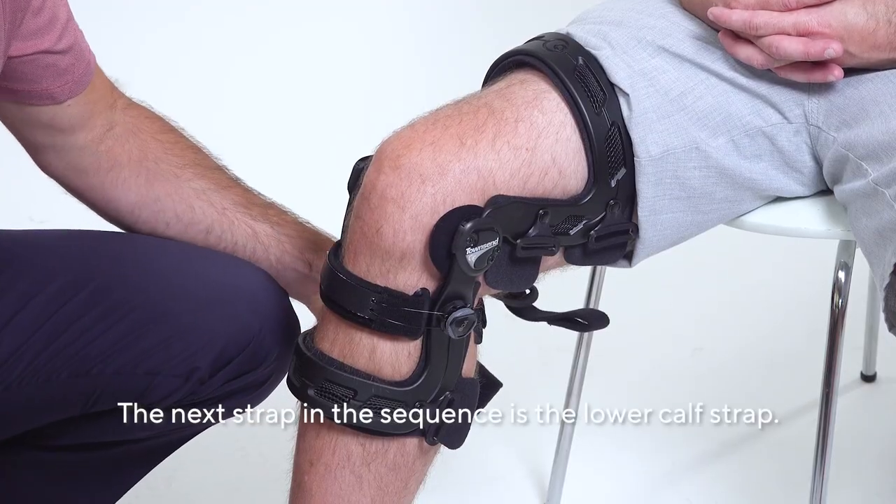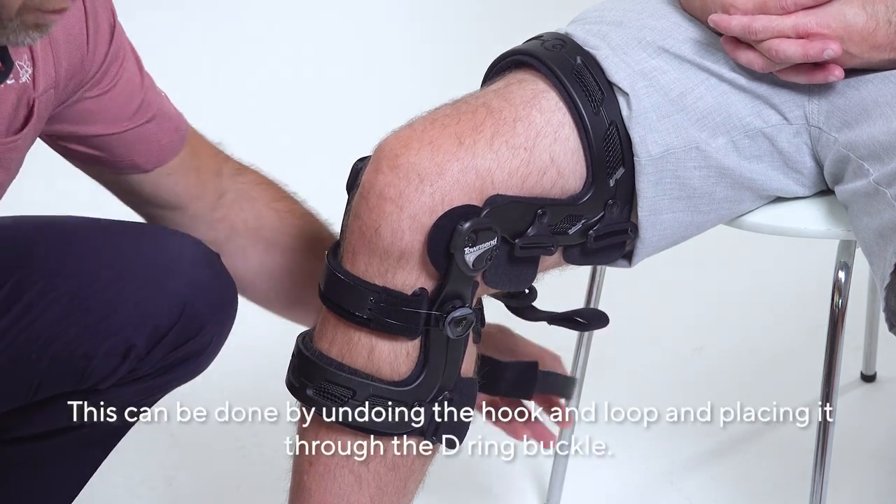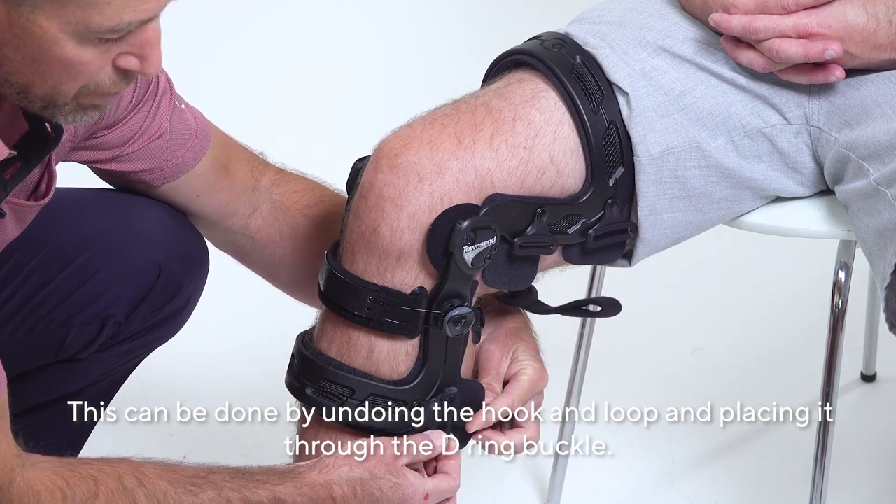The next strap in the sequence is the lower calf strap. This can be done by undoing the Velcro and placing it through the D-ring buckle.